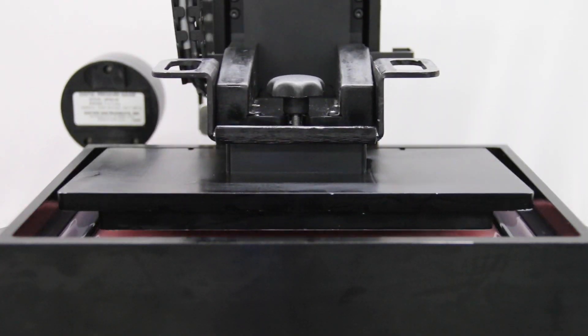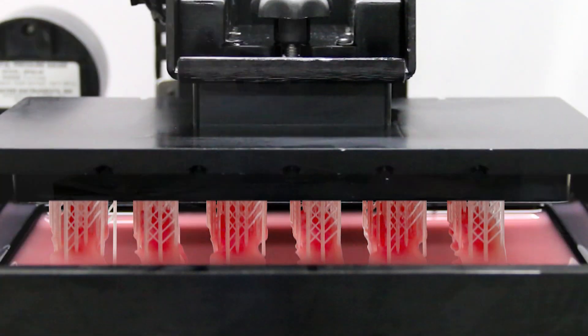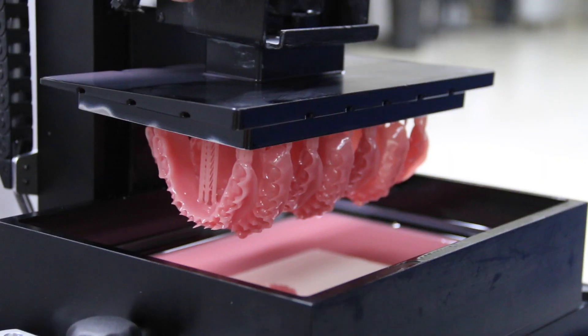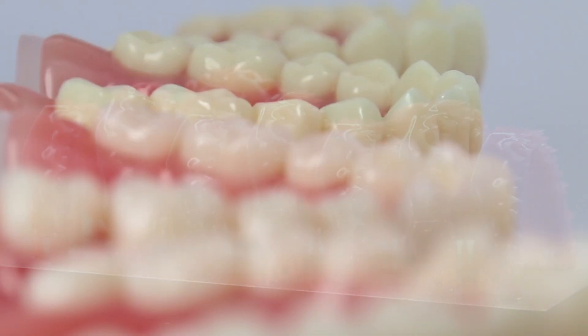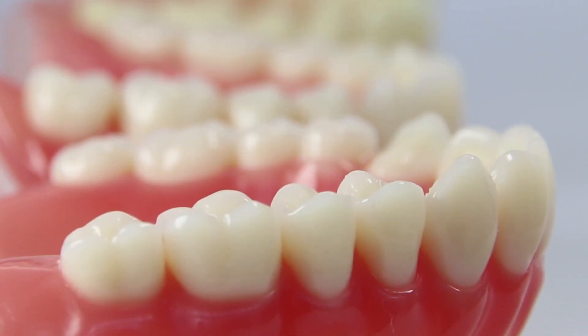Going into the next year, we'll be using the Envision 1 printers for complete dentures and partial dentures as well. I think it's a bright future ahead for dental technology and for the folks at Envision Tech, and we're very happy to have partnered with them on their printers.